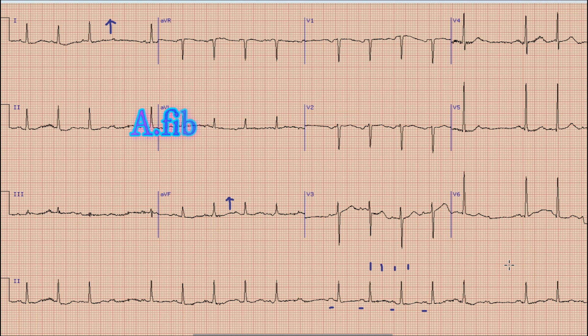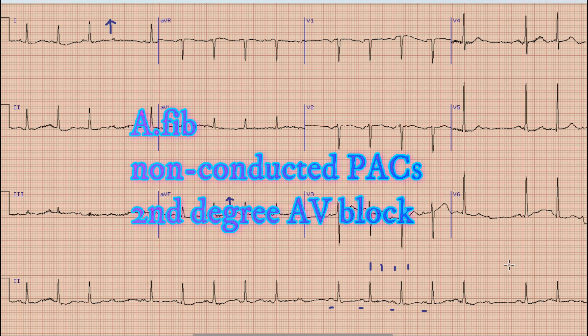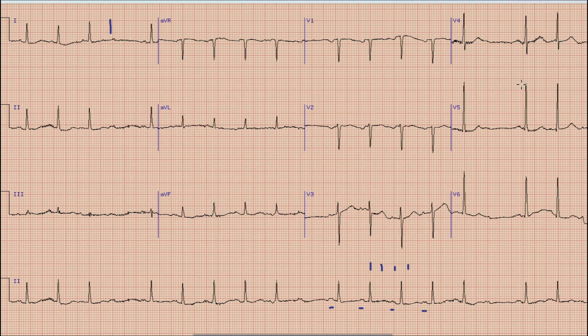One of the causes of irregularity is obviously atrial fibrillation, which we have already excluded due to the presence of P waves. Other causes include non-conducted PACs (premature atrial contractions not being conducted), or some kind of AV block such as Wenckebach or Mobitz I, or second-degree AV block. We'll find out what is going on here.